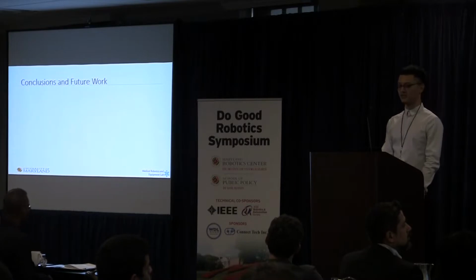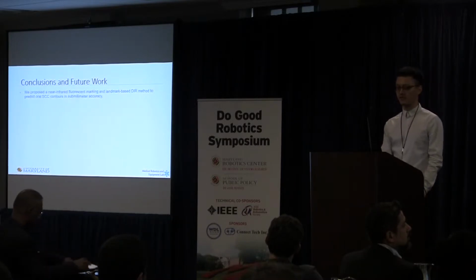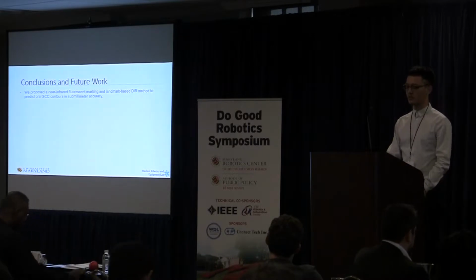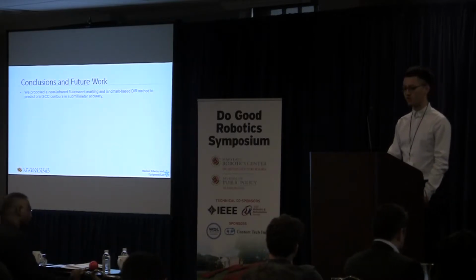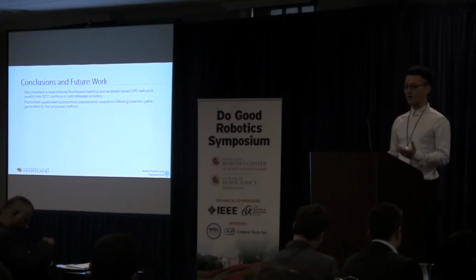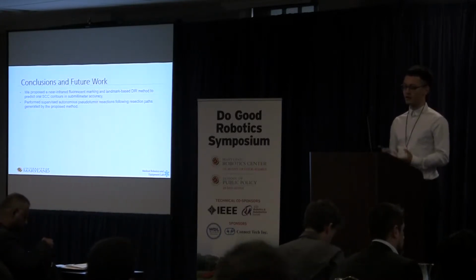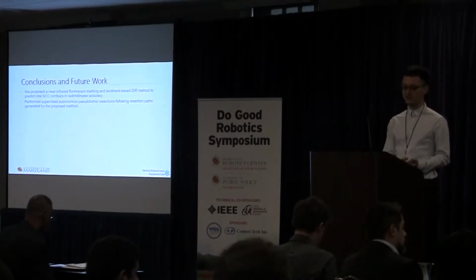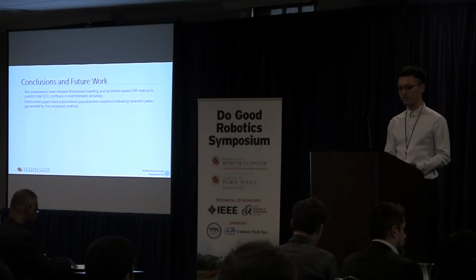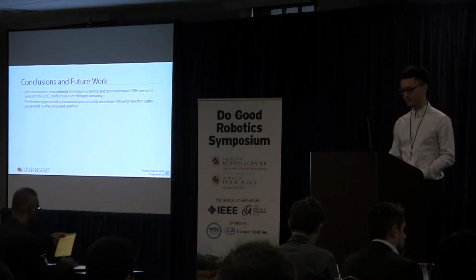Finally, the conclusion and future work. We first proposed a near-infrared fluorescent marking and landmark-based deformable image registration method to predict oral squamous cell carcinoma contours in sub-millimeter accuracy. What's more, we integrated this proposed marking and tracking algorithm into our robotic system and performed supervised autonomous pseudo-tumor resection.